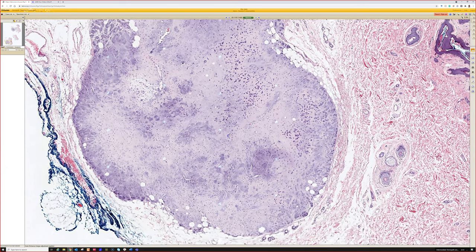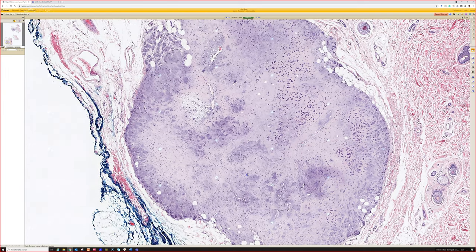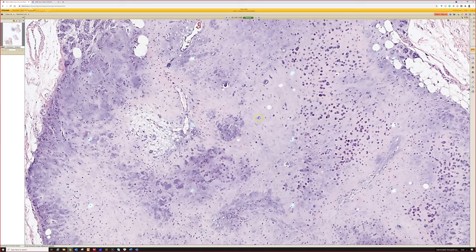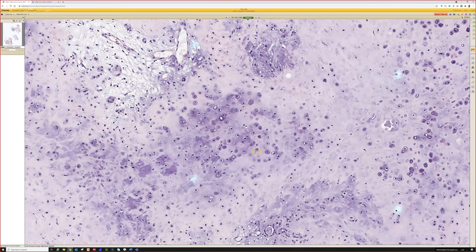Very good. Mixed tumor. Yes, and from low power, I would not in any way fault you for thinking that this is a chondroma, a benign cartilage tumor of soft tissue, chondroma of soft parts. This is incredibly chondroid in this case, and thus chondroid syringoma is another name for cutaneous mixed tumor, although they don't, to me, usually look anything like a syringoma, and they don't always have chondroid. So sometimes they do this. Sometimes they have perfect, well-formed cartilage and even bone, like this one, very nice, with chondrocytes in lacunar spaces.